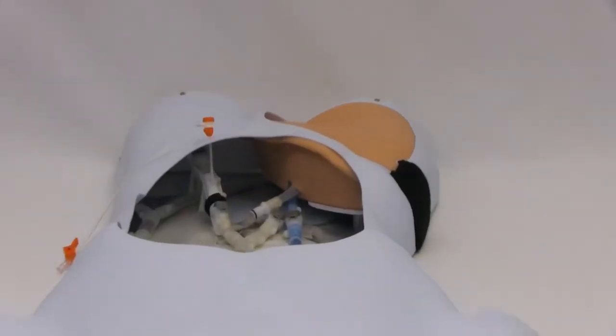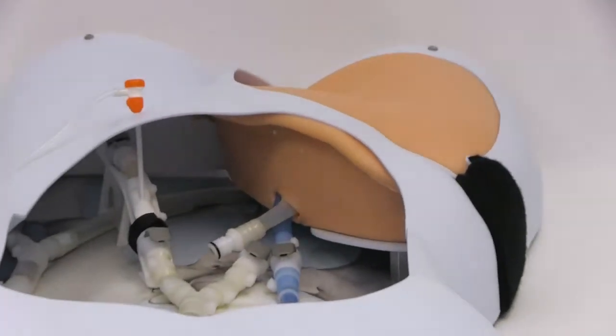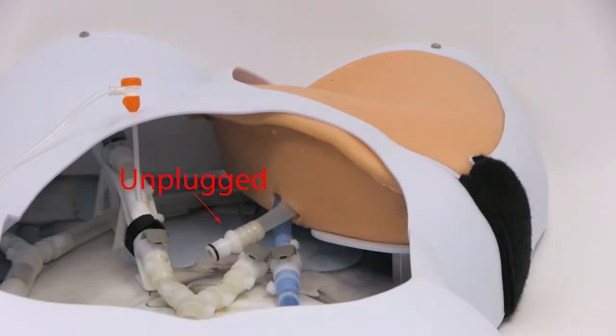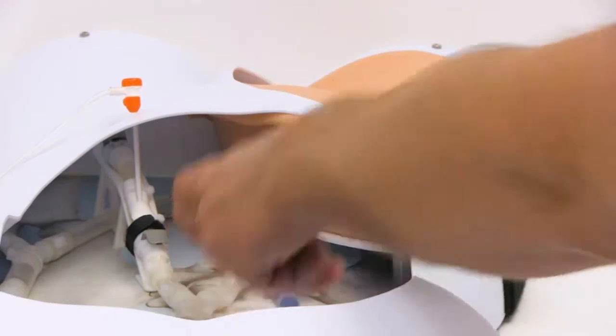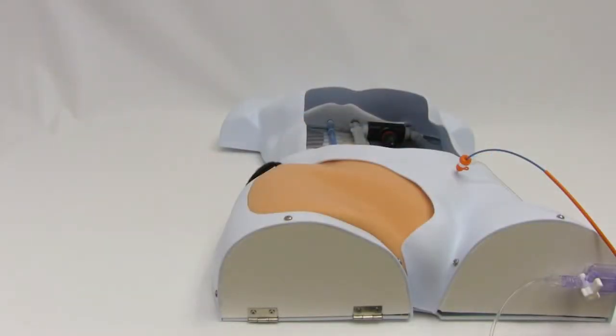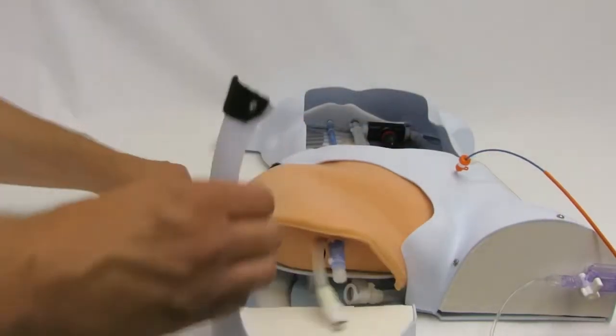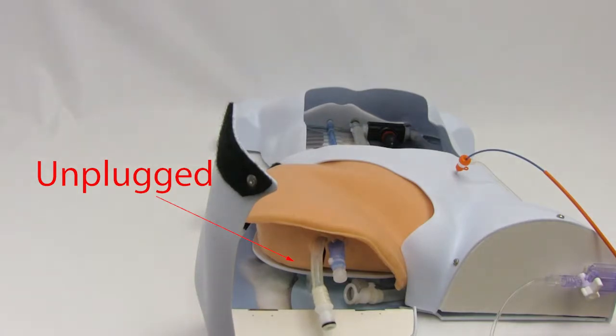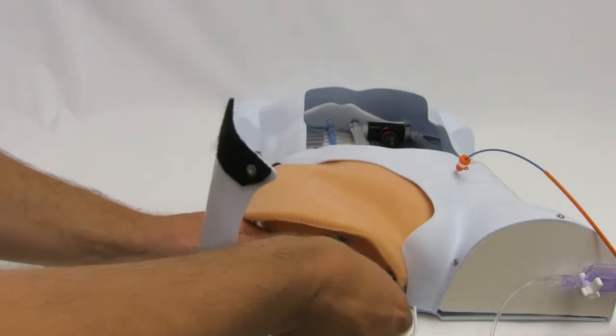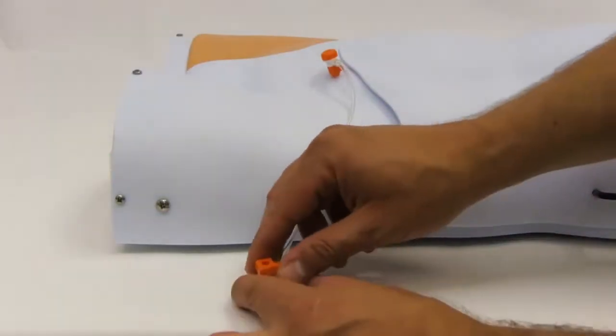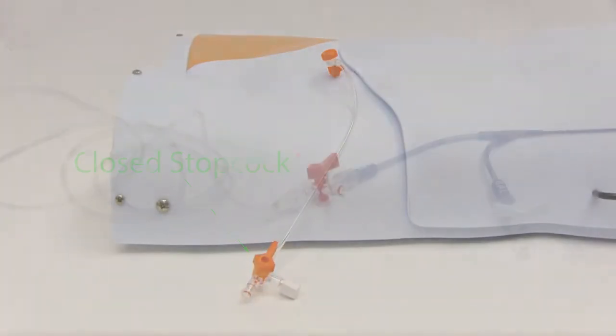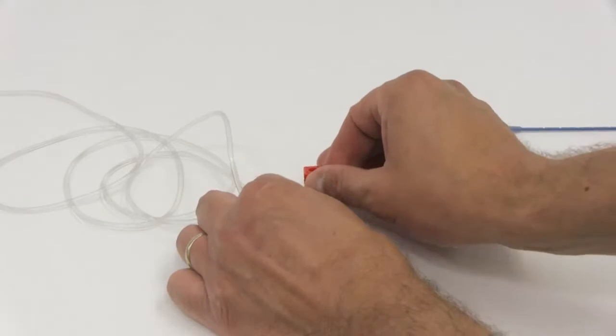Before turning on the pump, ensure that any leak points are closed off by checking the following: Ensure the thigh patch quick connections are plugged into the model in both the front and back. Ensure the introducer sheath's sidearm stopcock is closed. Ensure the artline stopcock is closed to atmosphere.